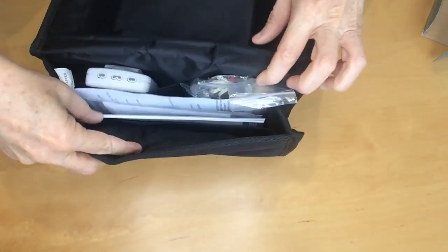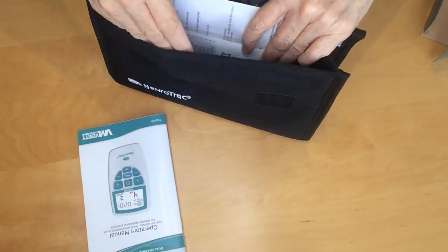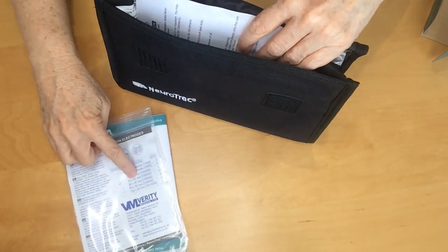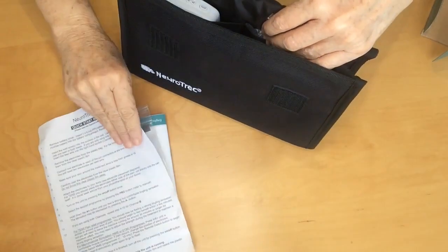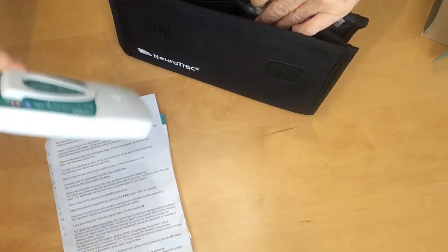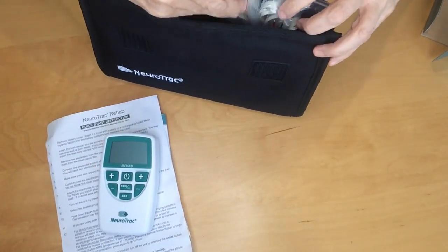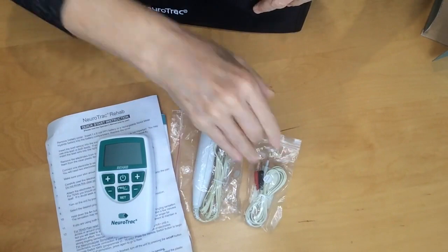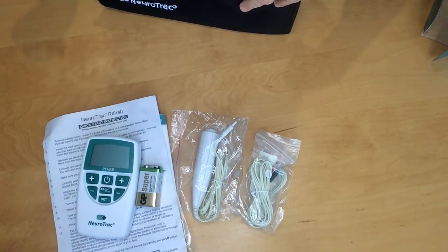As we get to look inside: the first thing is the operator's manual, which is quite extensive. These are the electrodes — 5cm x 5cm square electrodes. This is a quick start instruction leaflet. The device itself. The remote switch. Two sets of electrode leads. And a 9V battery.